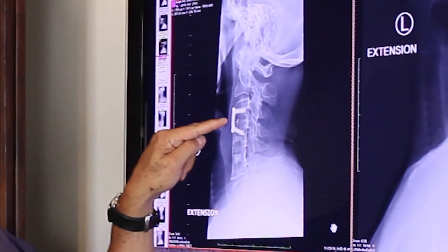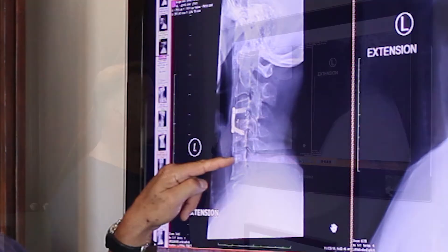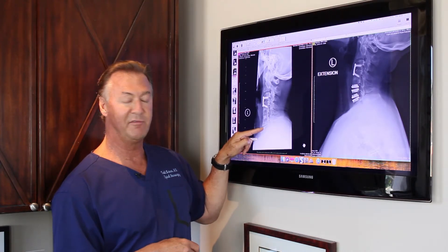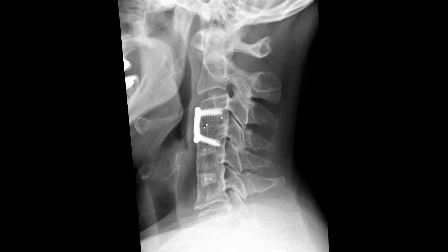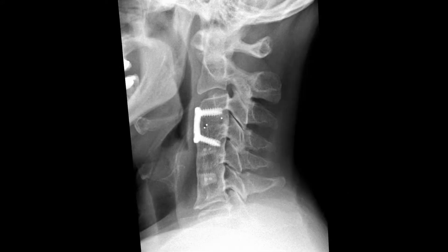If you look, you'll see three of her discs fused — one at the plate and screws and the two below it. The bottom disc in her neck needed attention; it was pinching a nerve and failing. On flexion-extension, watch the movement here — she does move, and so she was an artificial disc candidate at that level.